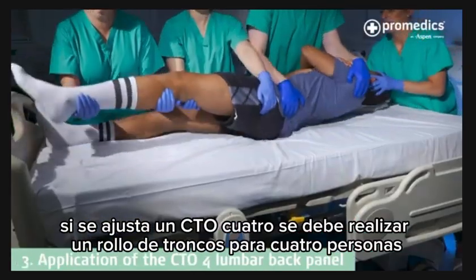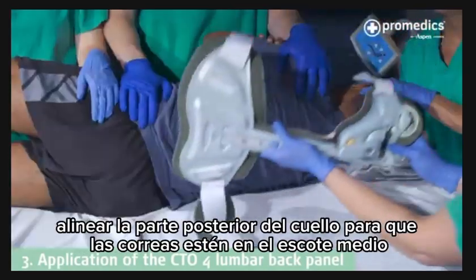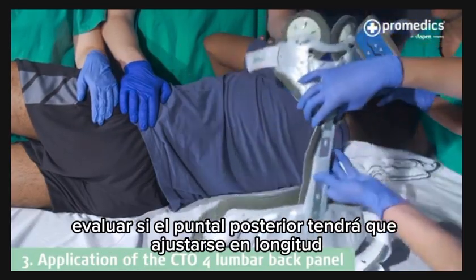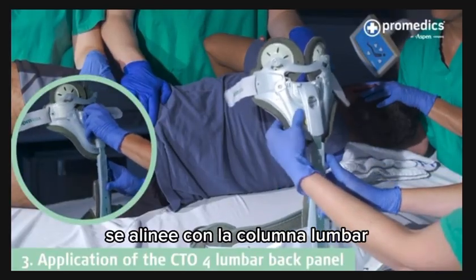If fitting a CTO4, a 4-person log roll should be performed. Line up the back of the collar so the straps are mid-neckline and then assess if the posterior strut will need to be adjusted in length so that the lumbar back panel aligns with the lumbar spine.